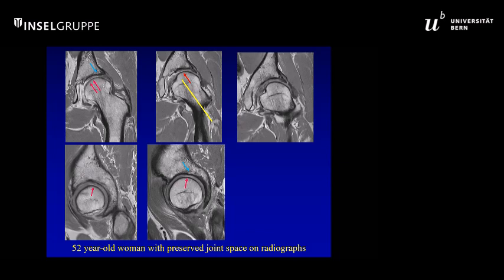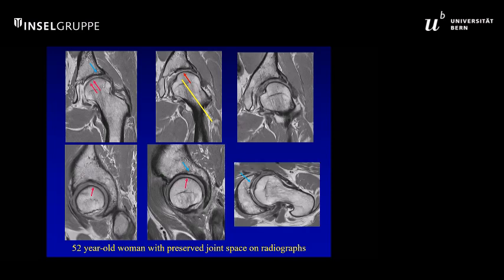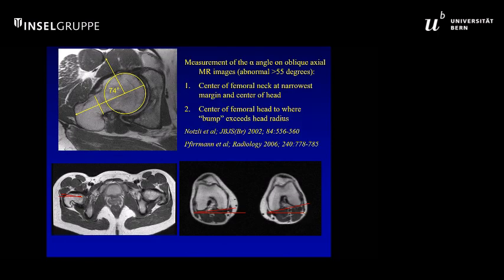Now, we can also routinely take axials along the long neck. And this was really devised here from the Swiss literature, where we use these routinely now. We call them our Swiss axials, simply because it was so nicely developed here, but you can evaluate the offset. And then, of course, this is now amenable to measuring on MR your alpha and beta angles.